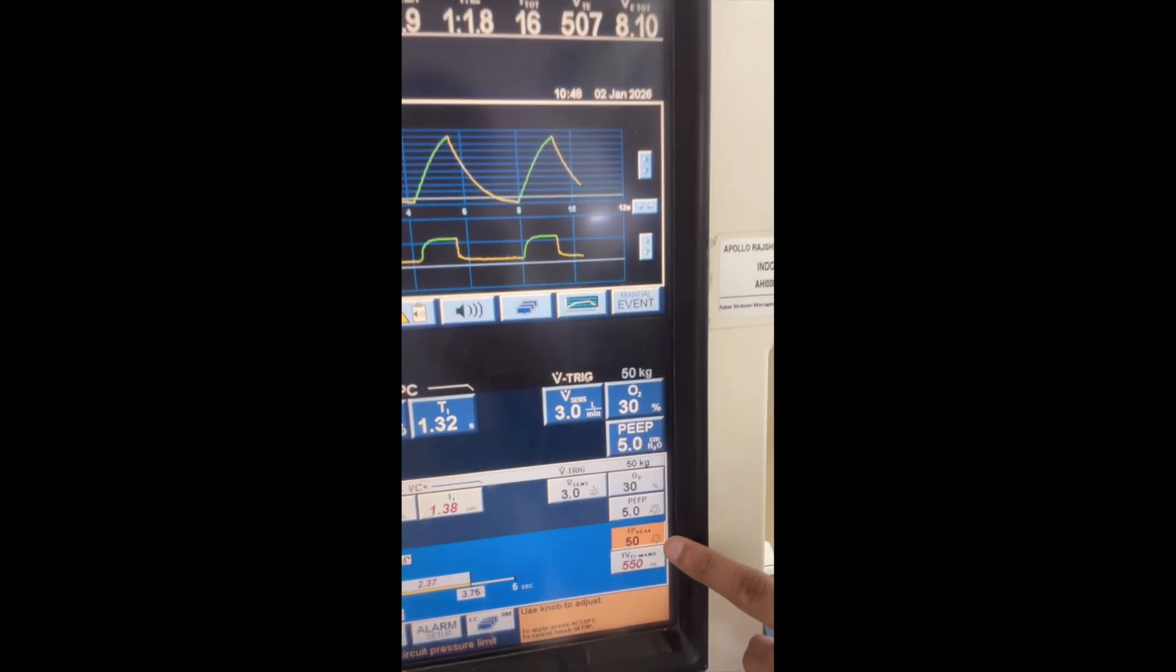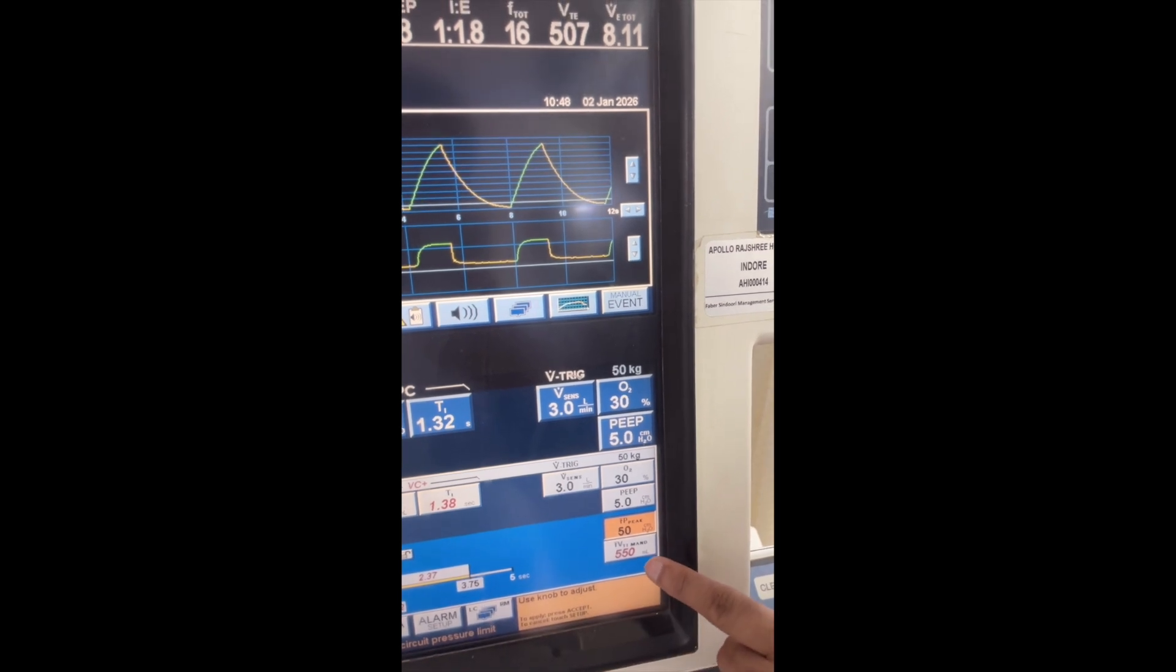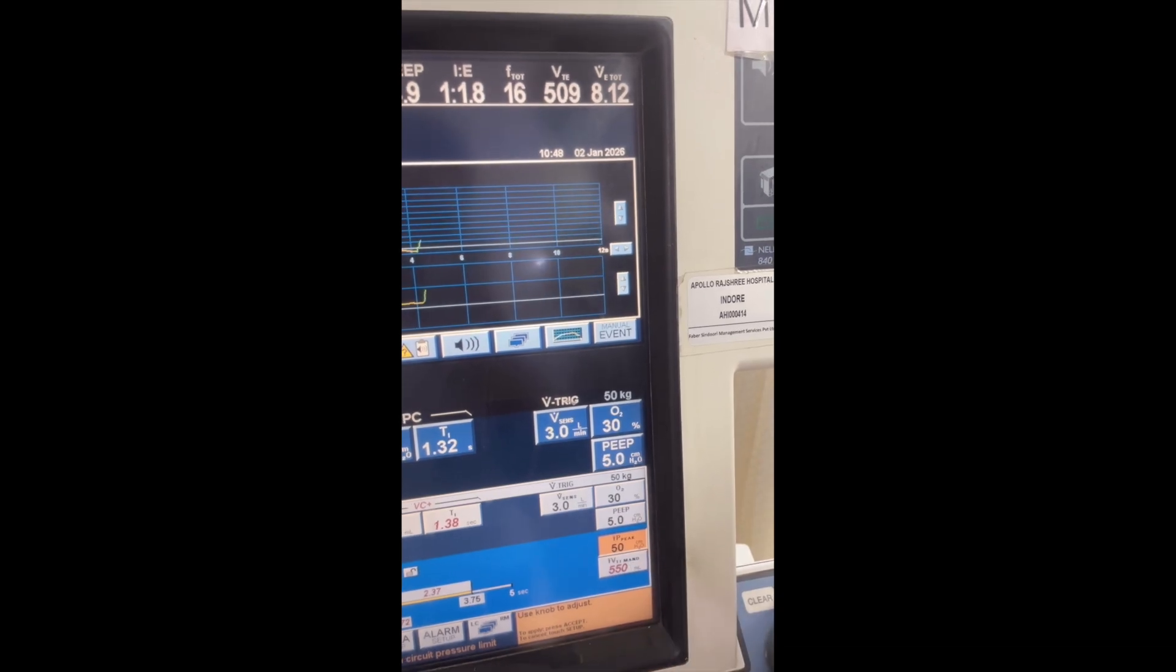This is the highest limit of peak pressure - beyond this the pressure will not increase to deliver this tidal volume. And this is the mandatory 550 tidal. If it goes beyond 550 tidal volume, then the ventilator cuts off with an alarm limit.